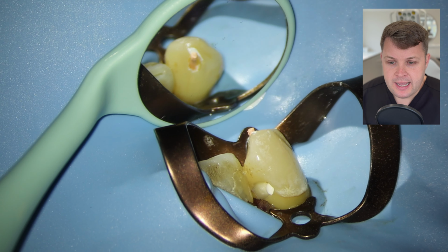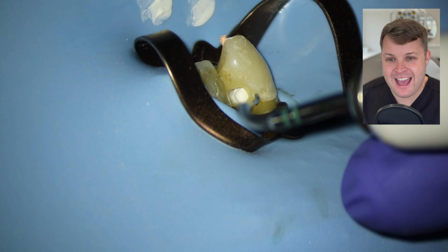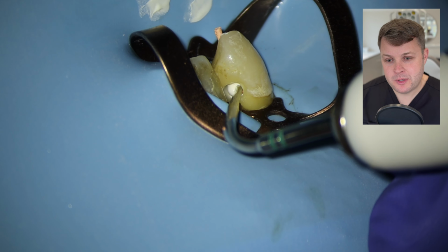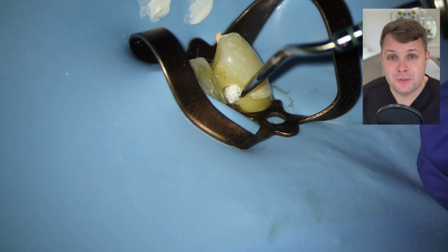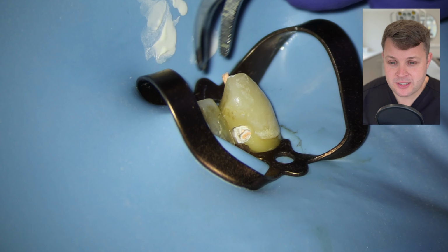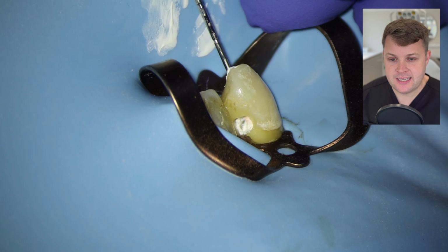flow around it. And I'm actually going to use the buccal access here just to cut off the excess of the GP, mainly because the conventional access through the incisal ledge is quite narrow, and it'd be difficult for me to get a heated plugger in that narrow access. And then I'm just going to condense it down with my Max 2 pluggers. I know that the GP cone fits really, really nicely to length.